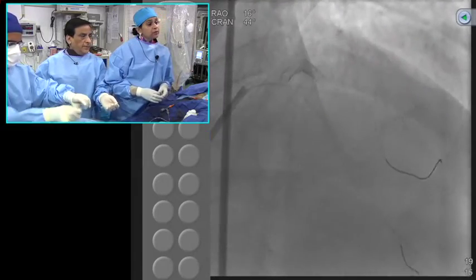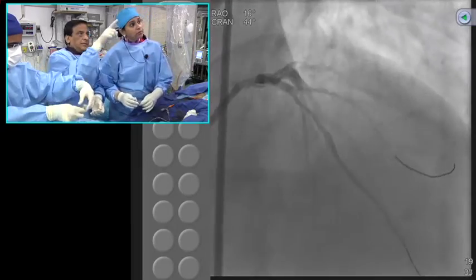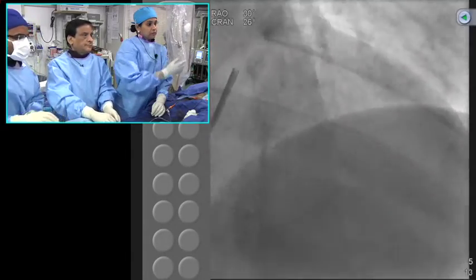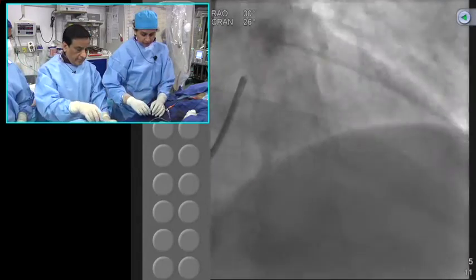No, there's a bridge. Cover it completely. See that? There's a bridge. I mean, that's what we are thinking. Should we or no? Yeah, although it's a bridge. See on the top? The first picture. See? That's a bridge. Yeah. You don't need to worry about it.